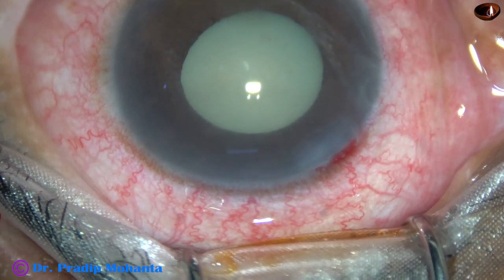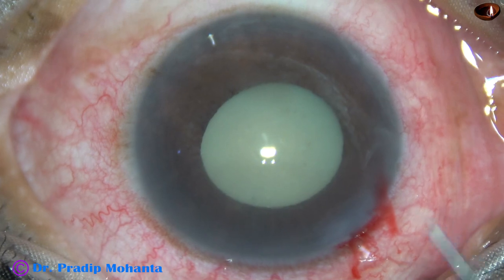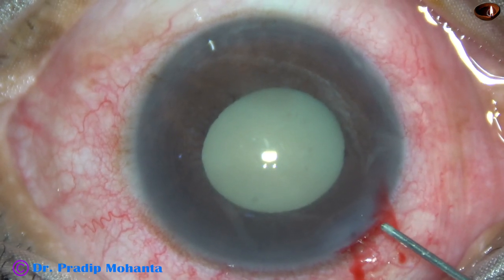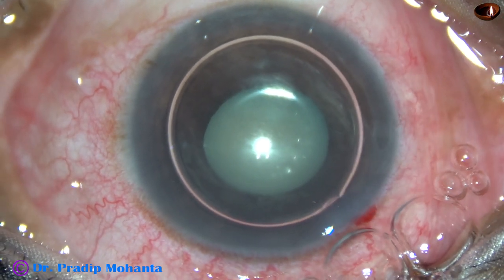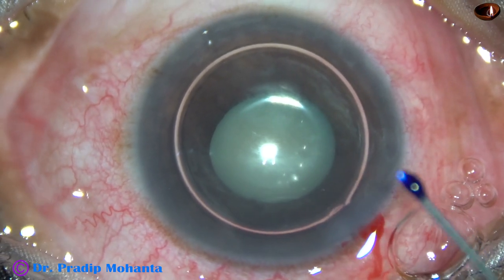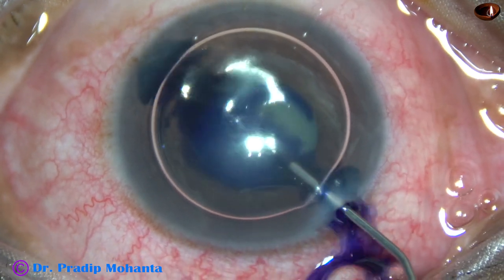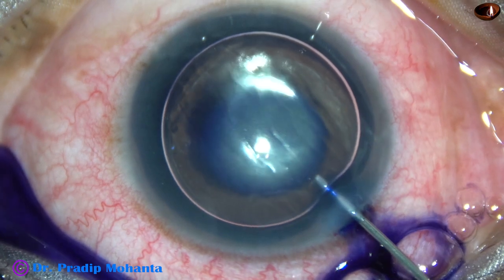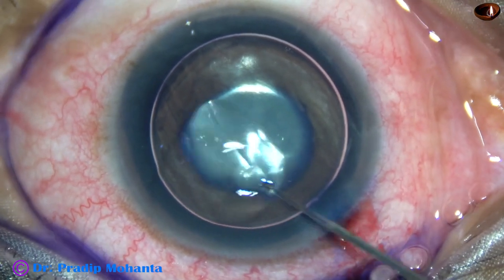Now an air bubble is injected into the anterior chamber. Beneath this air bubble, trypan blue dye is applied over the anterior capsule of this hypermature Morgagnian cataract.